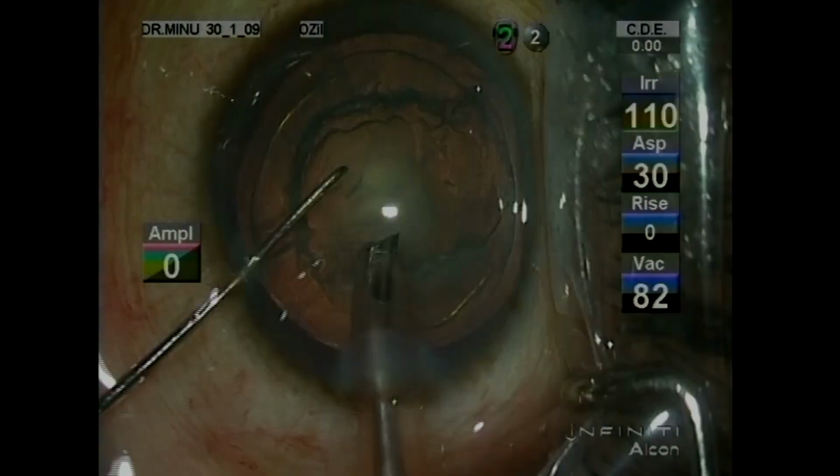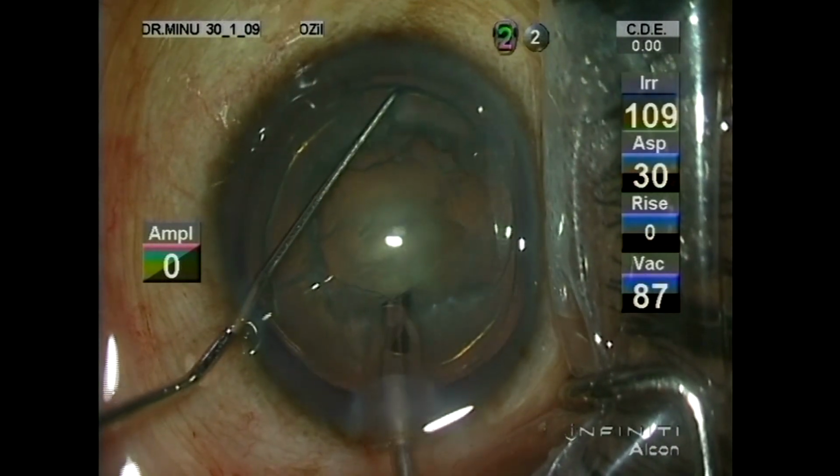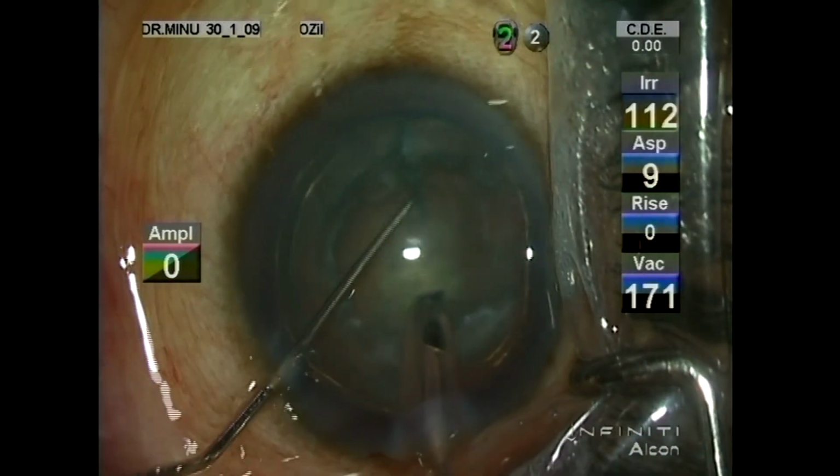My third phaco case as a trainee, I remember, it was this kind of a cataract. I was very cool, okay, soft cataract will just come. 1, 2, 3, 4, everything gone, center. Now the periphery is not coming. I was scared to go to the periphery to catch it, afraid I would catch the PC. So I had to call my trainer to complete that. So he did it coolly. What is that move? But initially we will think that it is soft.